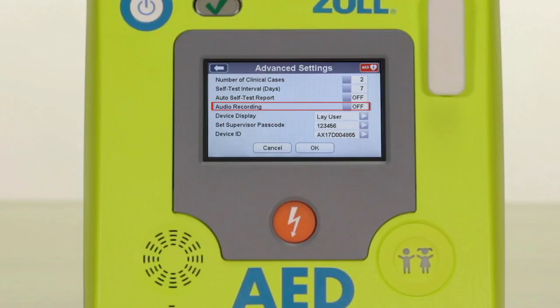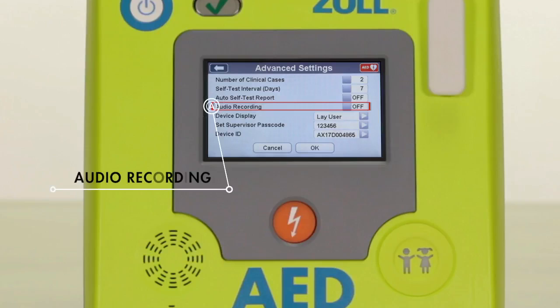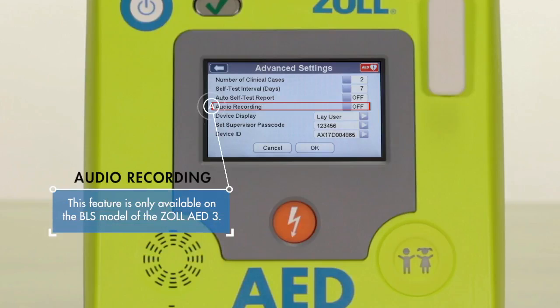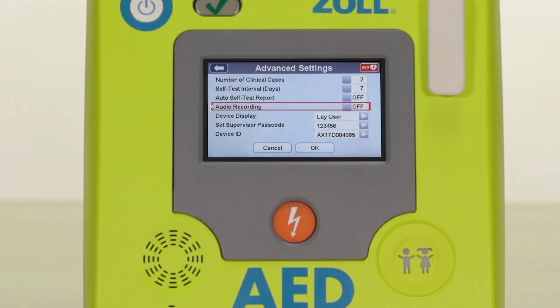In some instances, a responder's protocols may call for the use of audio recording when an AED is used in a rescue. The default setting for this feature is off because the majority of response protocols do not call for it. However, if your specific response protocols do call for audio recording, you may enable this feature by selecting on. Note that this feature is only available on the BLS model of ZOL AED3.